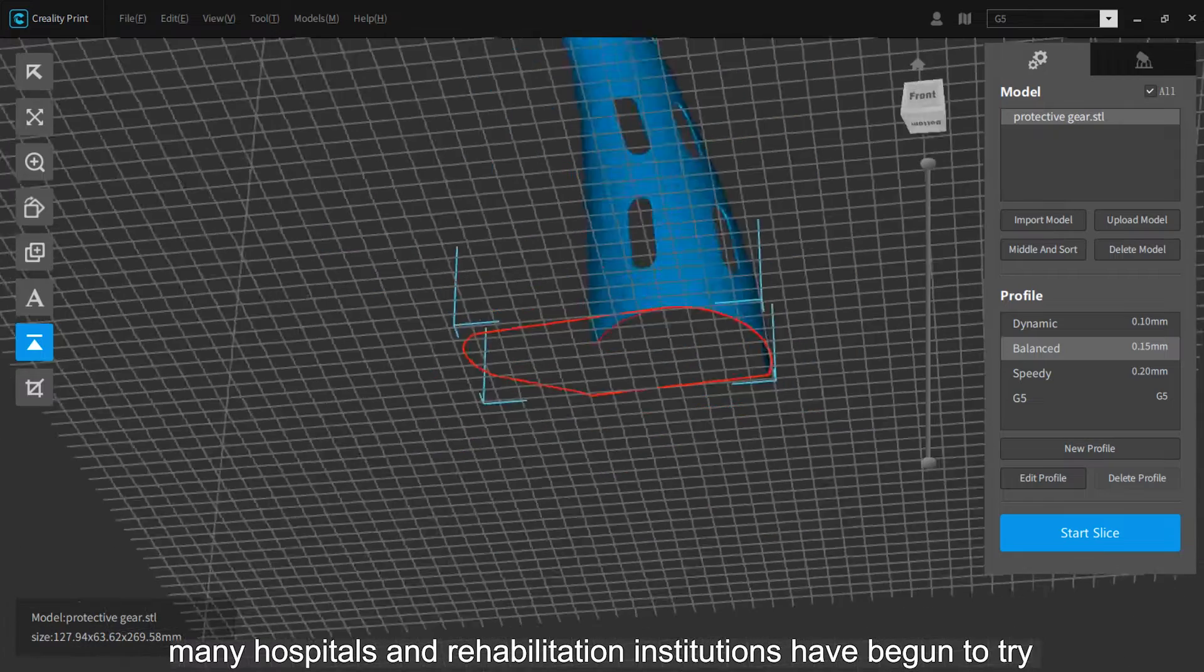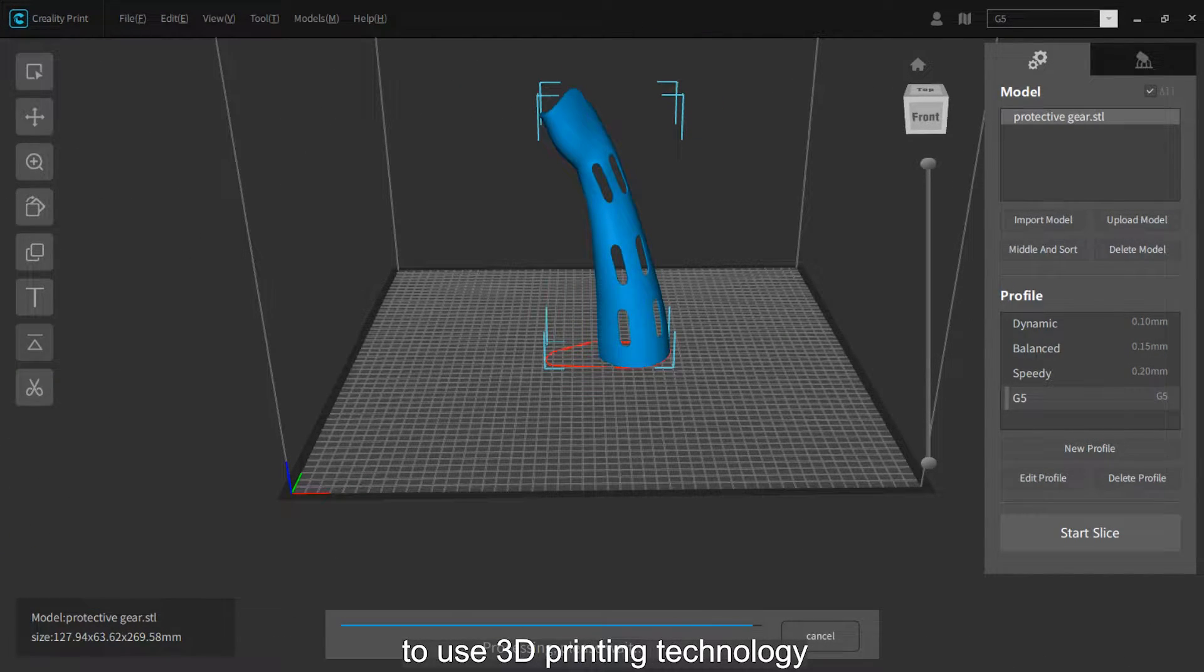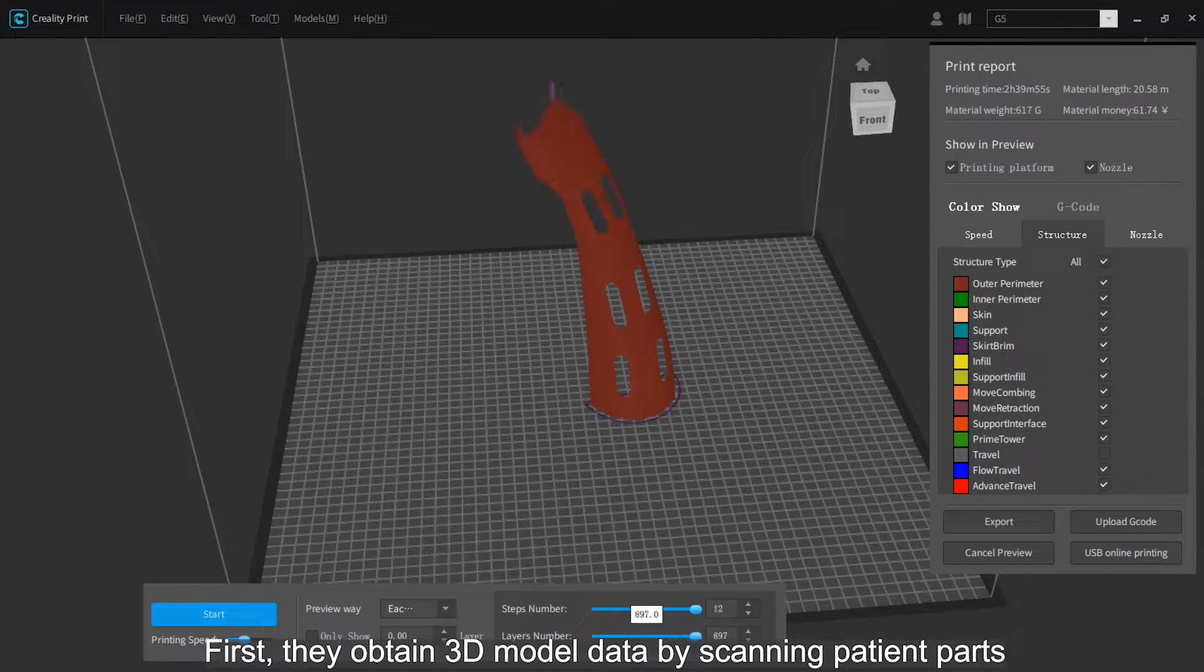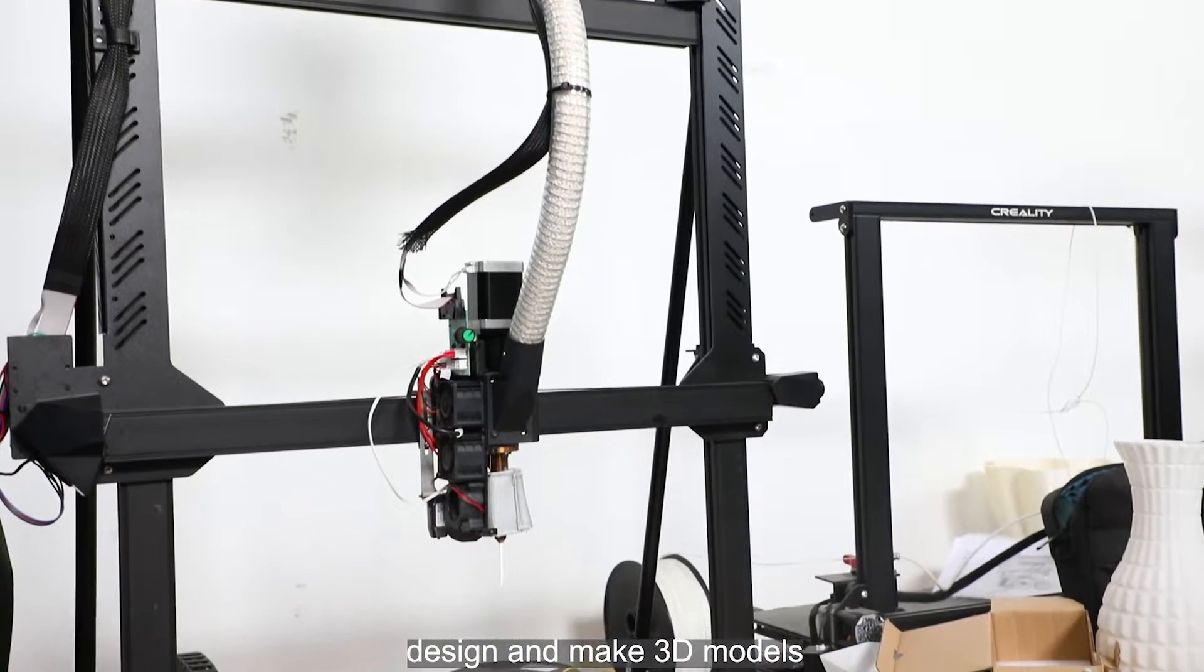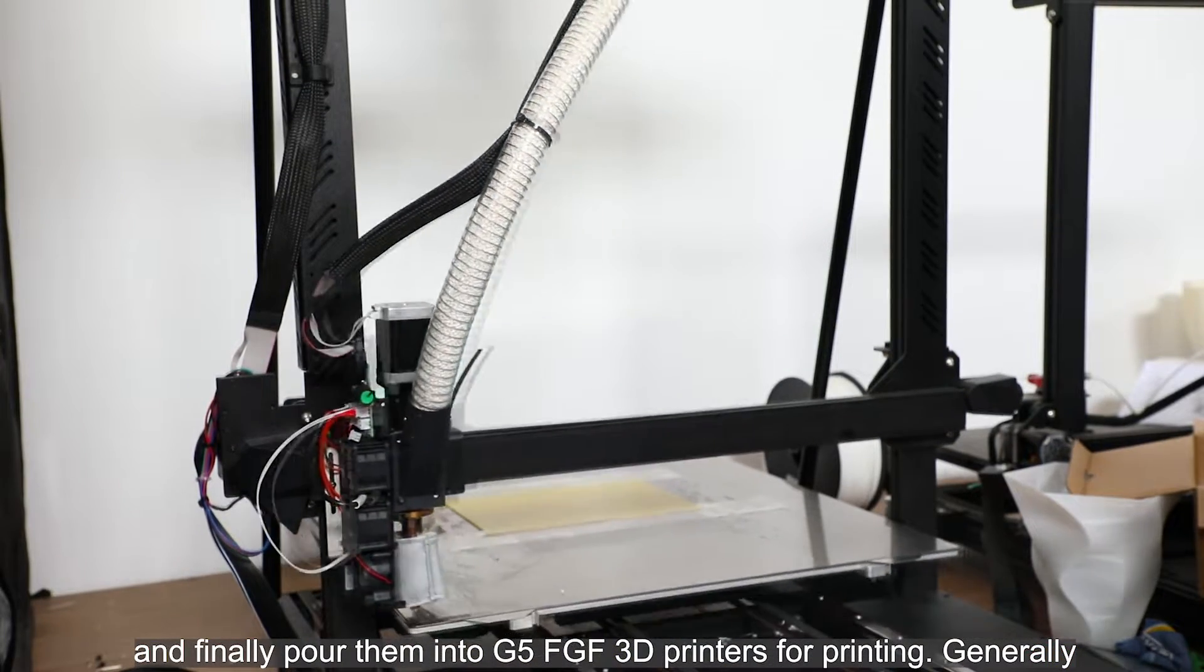With the improvement of digital technology, many hospitals and rehabilitation institutions have begun to use 3D printing technology. First, they obtain 3D model data by scanning patient parts, then design 3D models, and finally send them to 3D printers for printing.